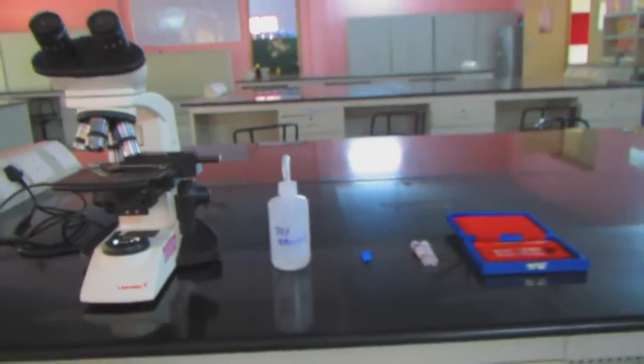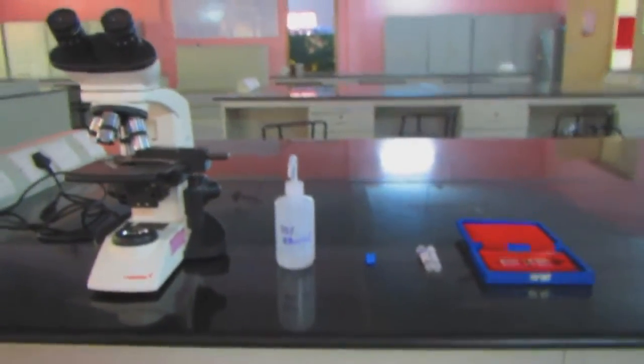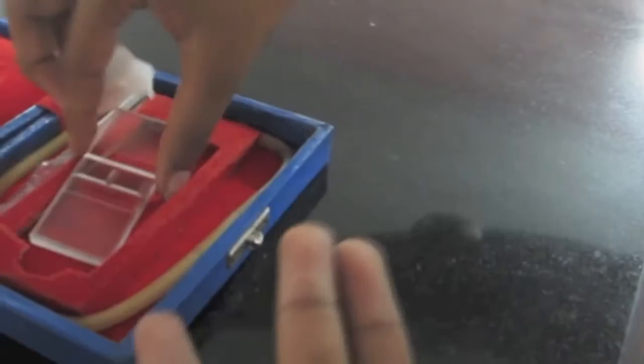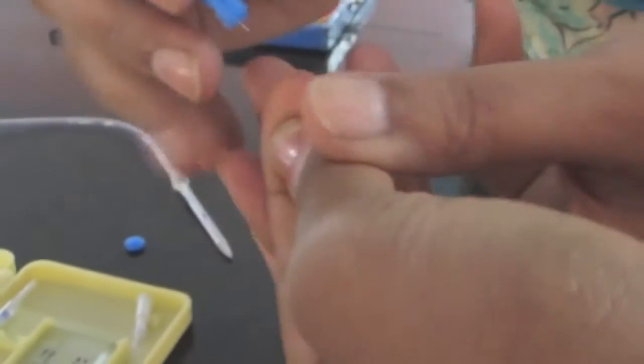Methodology. The materials needed for the experimental procedure are placed on the working table. The hemocytometer is taken and wiped using 70% ethanol. For collection of blood, first the finger from which the blood is to be collected is sterilized using 70% ethanol and pricked using a pricking needle.